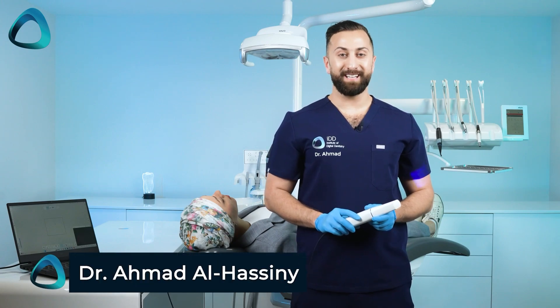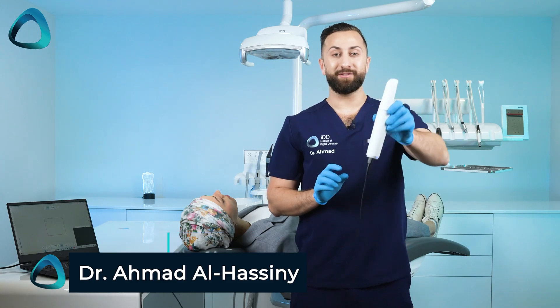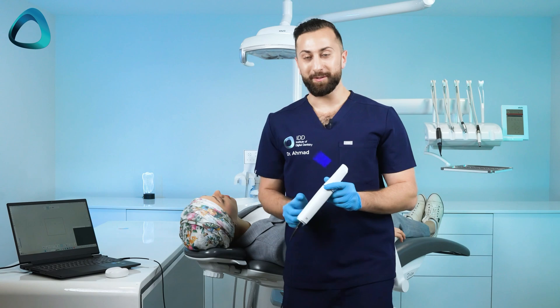Hey guys, Dr. Amar Al-Hasni here from the Institute of Digital Dentistry. Today I have the Meta i900, so let's see how it scans on a live patient. Let's get into it.